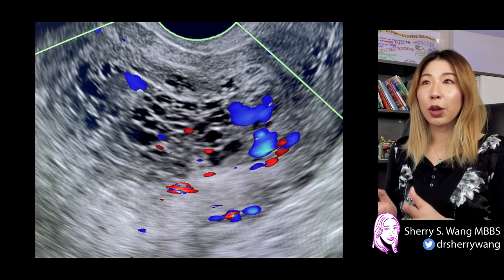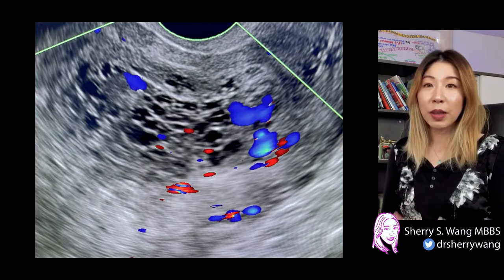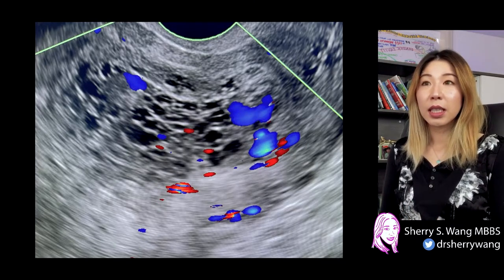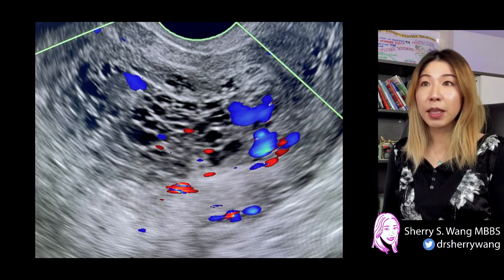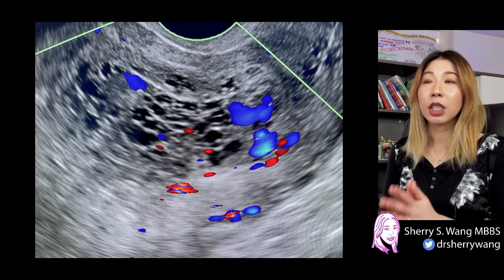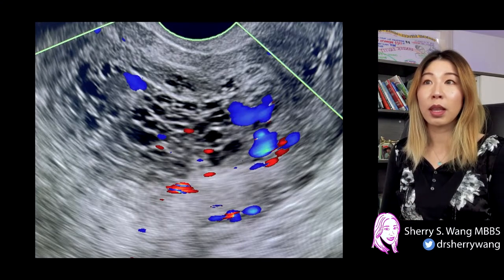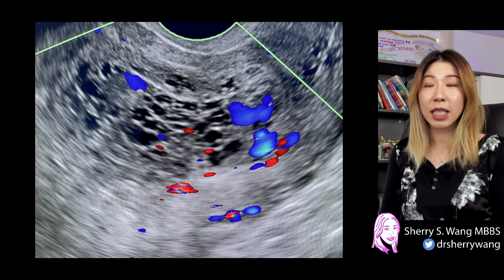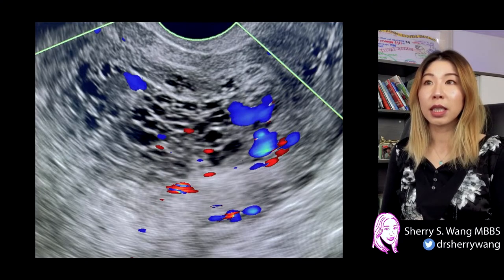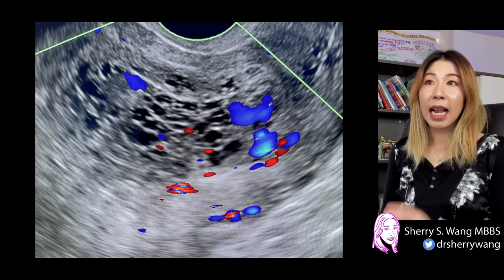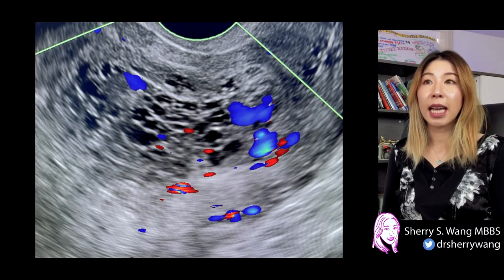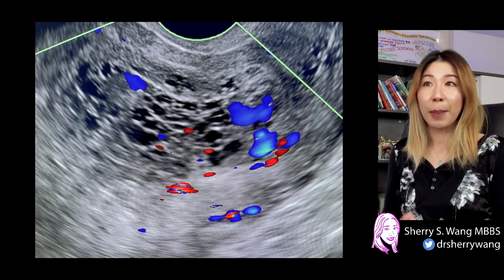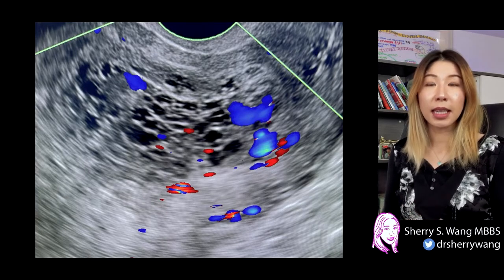Now let's quickly go through this image first. This is a transvaginal ultrasound and it demonstrates that there is a soft tissue mass within the intrauterine cavity with a lot of cystic spaces. We see that color Doppler has been utilized and this indicates that this intrauterine mass is vascular.